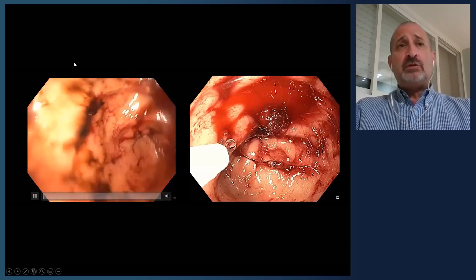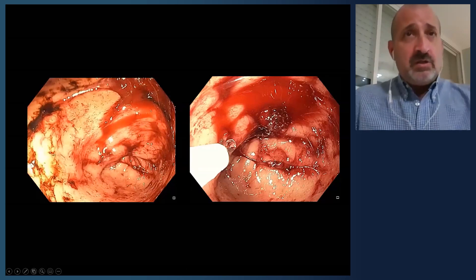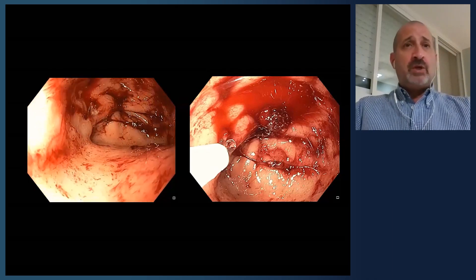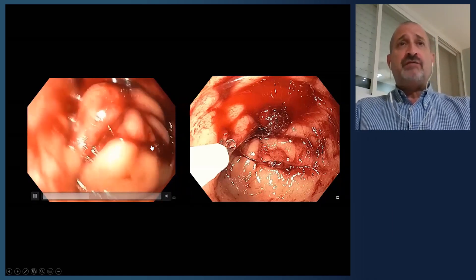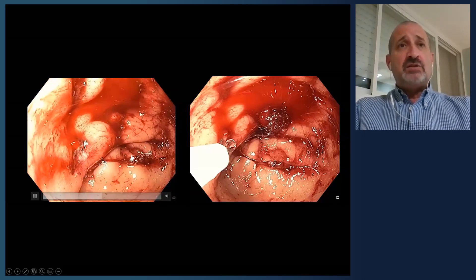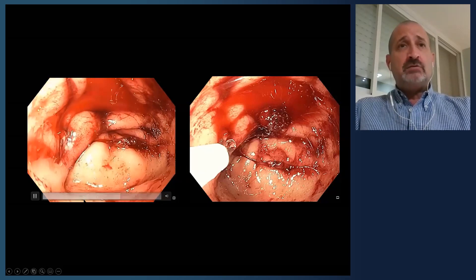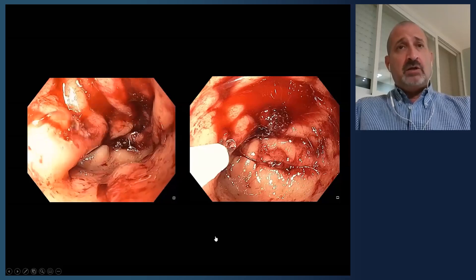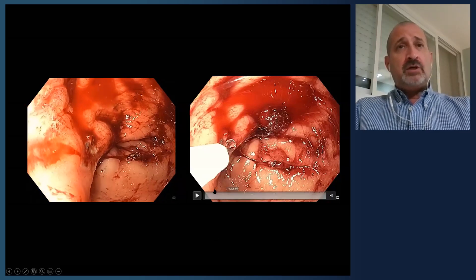This patient was scoped. In the stomach, you can see fresh blood, and on the left side in the antrum — right in the pre-pyloric area — this is a Forrest 1a lesion. This patient has spurting bleeding. The video runs a little slow but there is active spurting bleeding present.